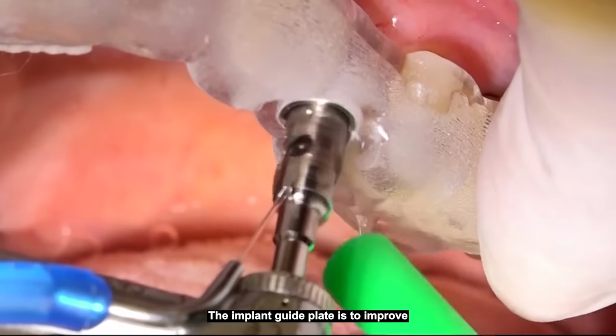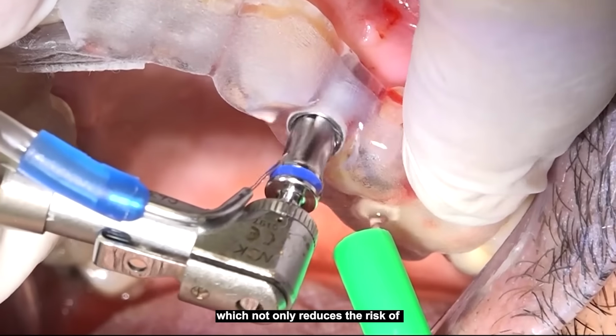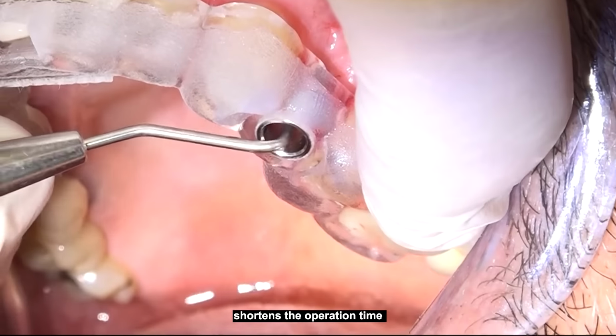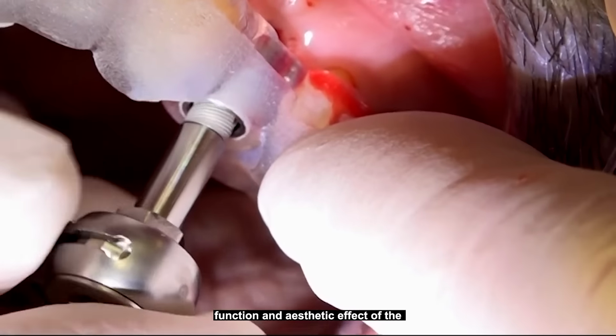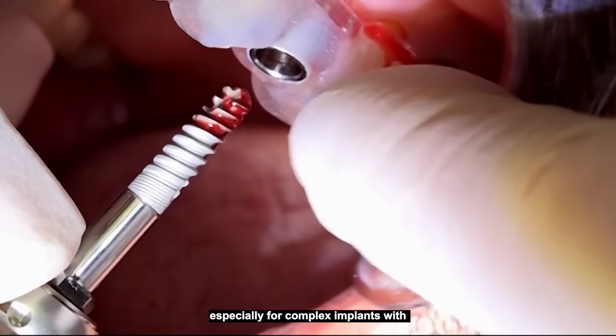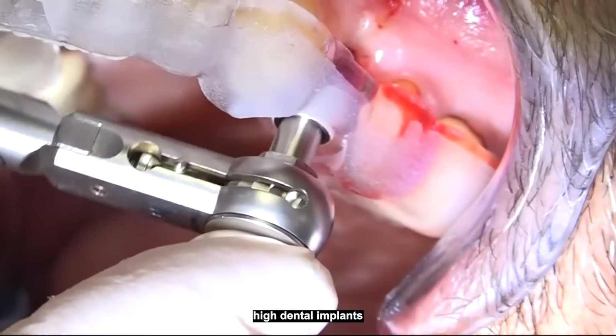The implant guide plate is to improve the accuracy of implant placement and simplify the surgical plan, which not only reduces the risk of surgery and shortens the operation time, but also ensures the occlusal function and aesthetic effect of the restoration, especially for complex implants with high implant requirements. It is more valuable for patients with high dental implant requirements.